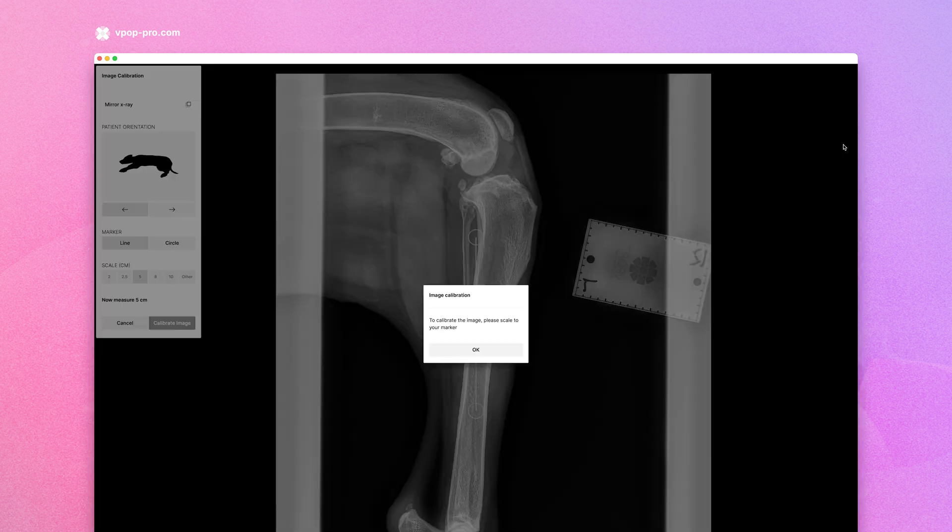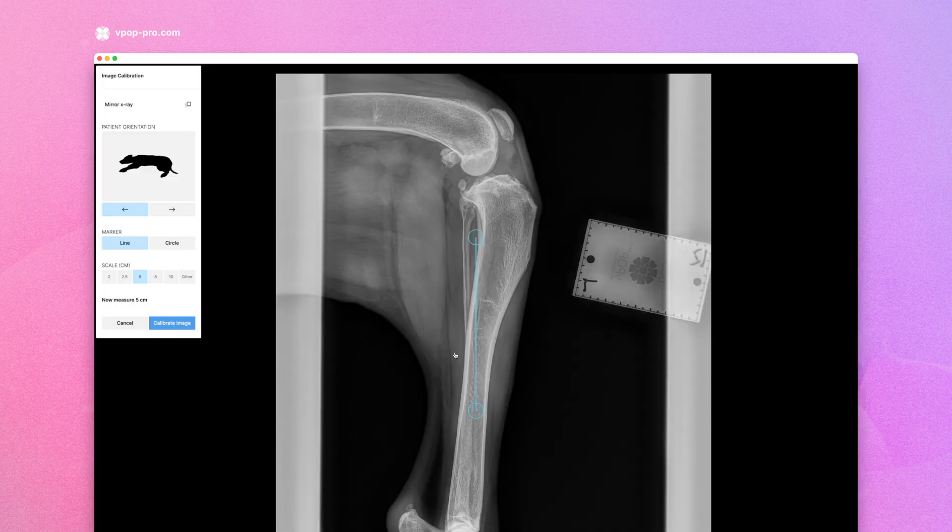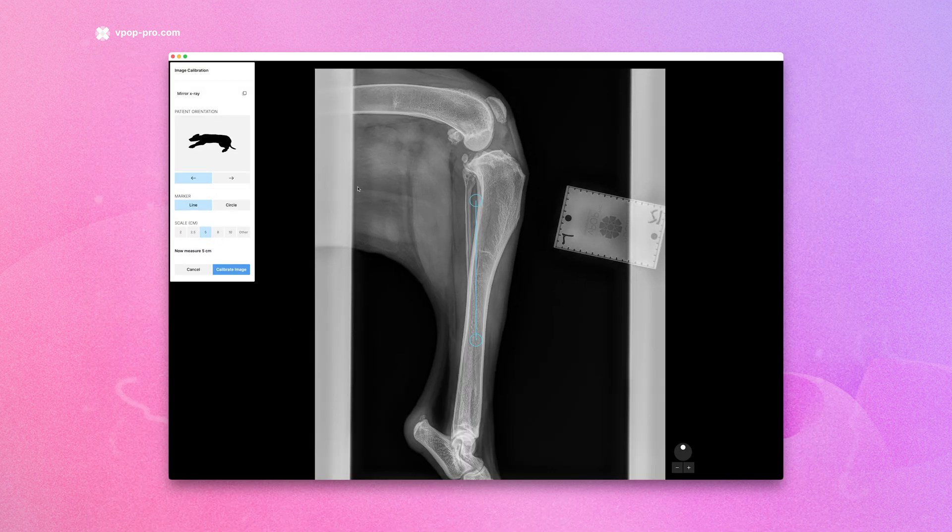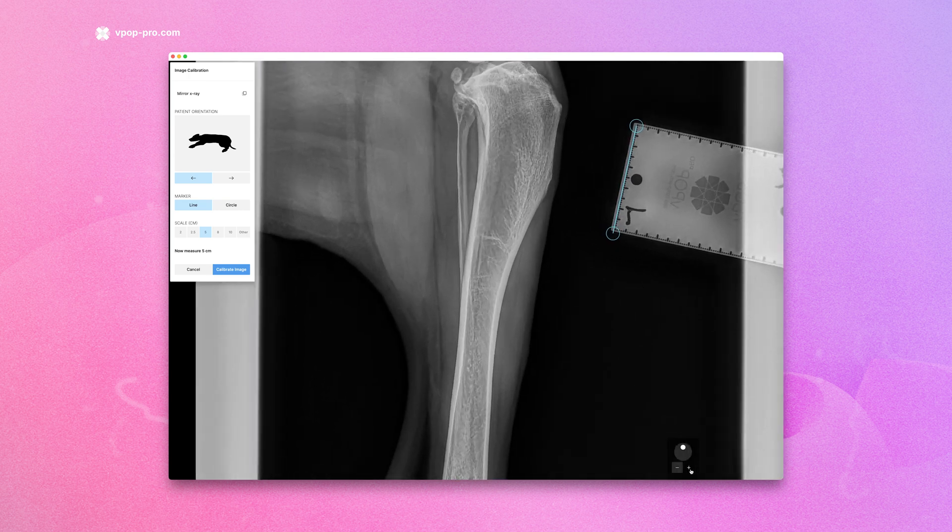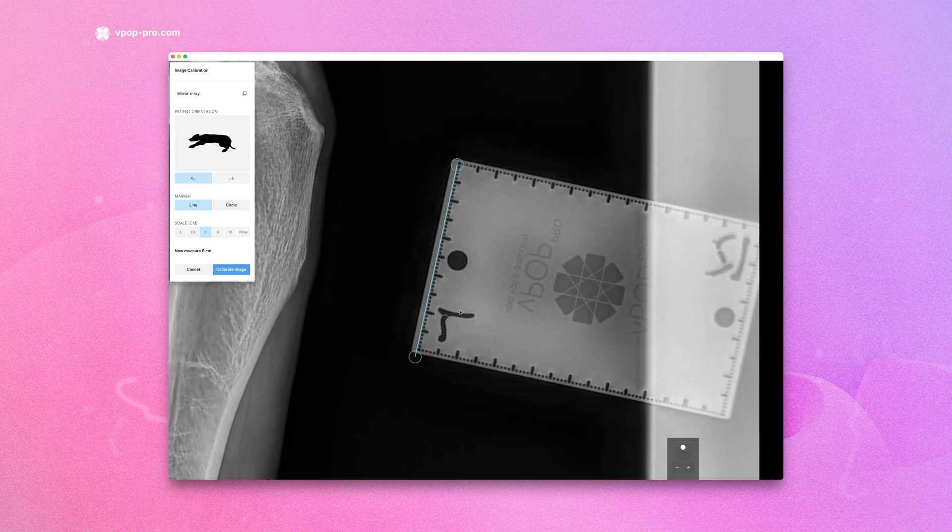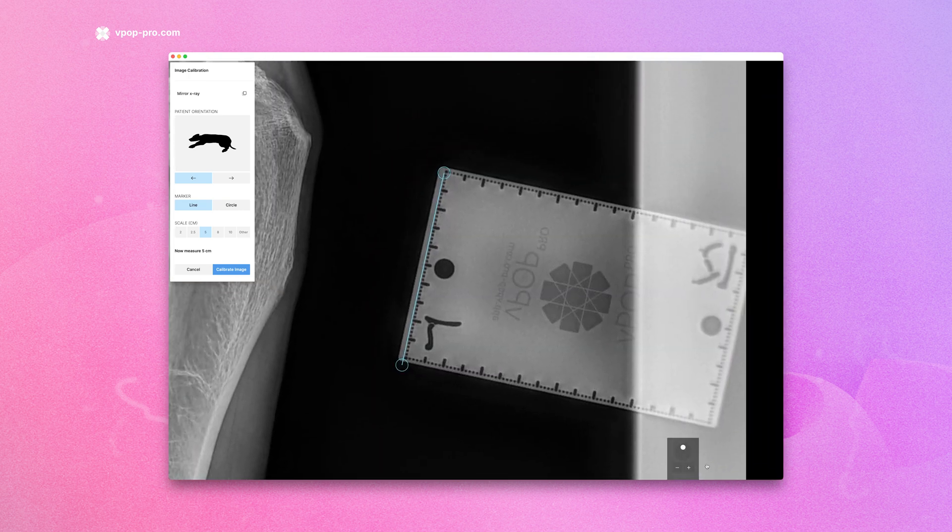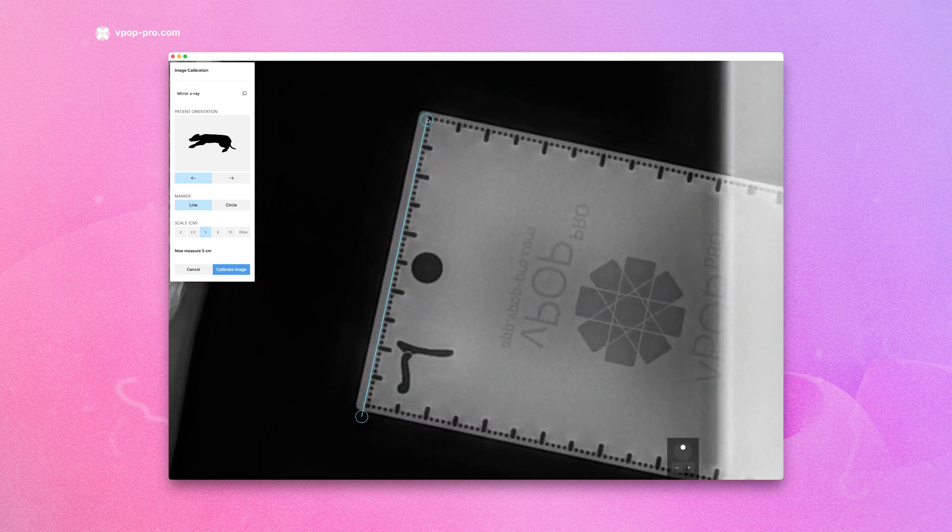On the right-hand side menu, select Image, then click Calibrate. Choose the type and scale of your marker and use the line tool to measure the marker in the image. Accuracy here is crucial.